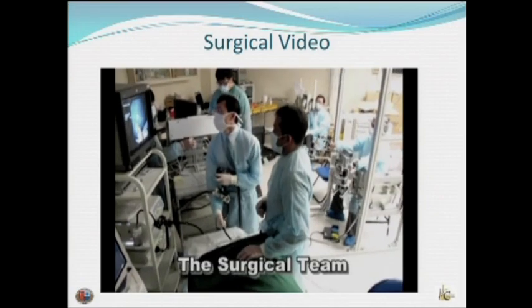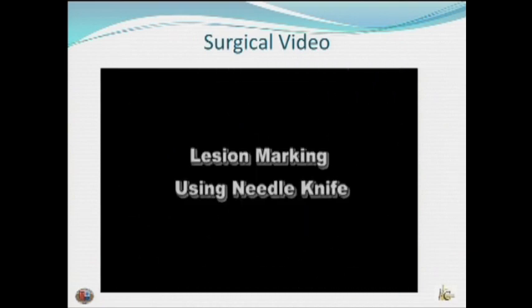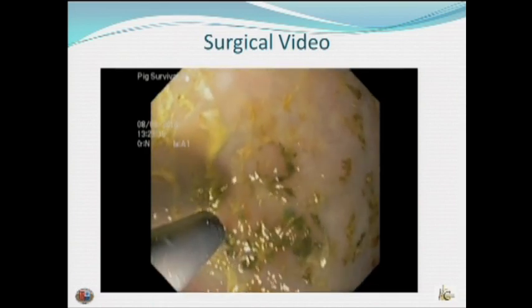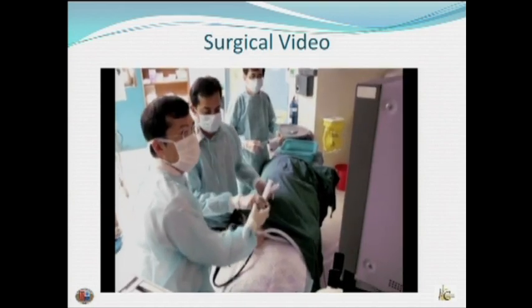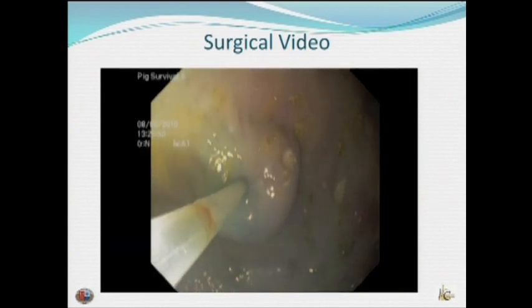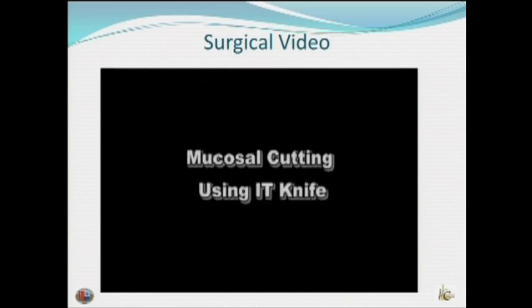Coming to the surgical video, this is the surgical team, which needs an endoscopist and a surgeon. The surgeon controls the master robot and the endoscopist controls the slave manipulators. Initially, through the normal endoscope, we use a marking knife to mark a circumferential lesion. After marking, we inject a submucosal injection of methylene blue dye, diluted with 40 ml of normal saline, to elevate the lesion. After this, we use an IT diathermic knife to make a circumferential cut.